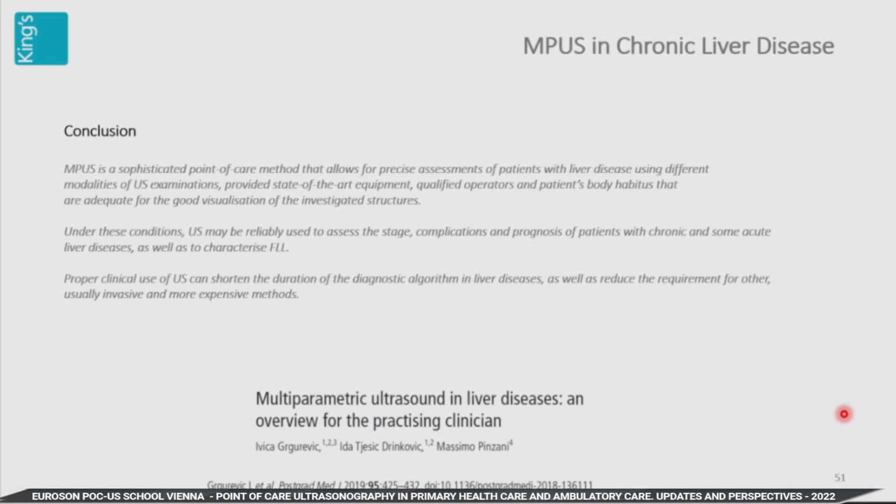You've got your B mode on the texture of the liver, irregularity of the surface, the size of the liver. You have your color Doppler, microvascular imaging, spectral Doppler to look at the portal vein, hepatic artery, and hepatic veins. You have focal lesions you see on B mode. You can use contrast to immediately classify that lesion into benign or malignant.